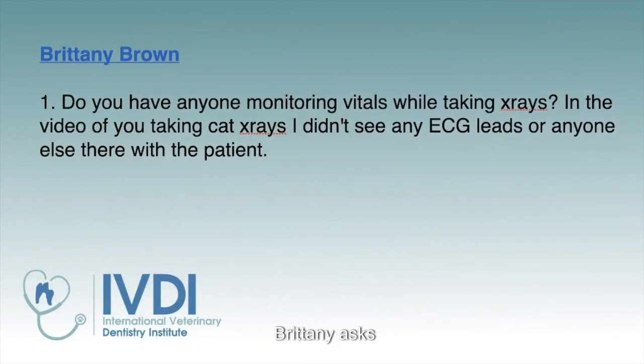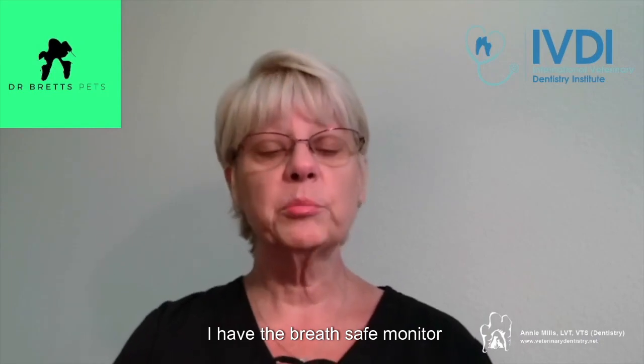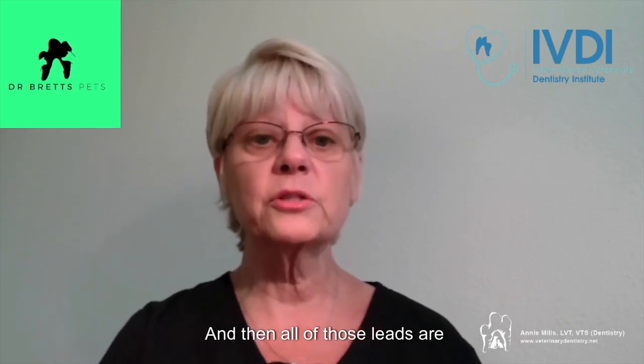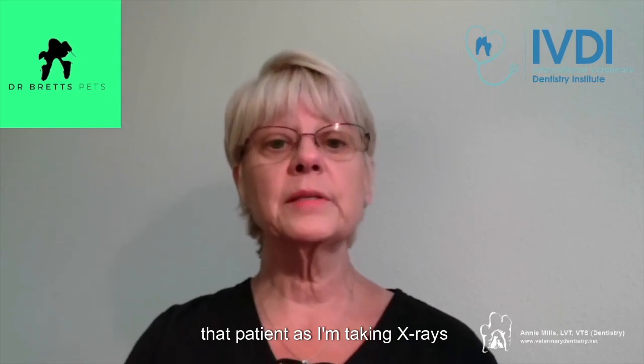Alrighty, Brittany asks, do you have anyone monitoring vitals while taking x-rays? In the video, you're taking cat x-rays. I didn't see any EKG leads or anyone else there with the patient. So when I induce a patient, they are sternal at that point. I'm going to put pulse ox on them right away. I have the Breathe Safe monitor, so I know that they're respirating. Typically, it's only maybe 5 minutes, then I'm turning them into dorsal recumbency, and then all of those leads are going on. But I am monitoring that patient as I'm taking x-rays.